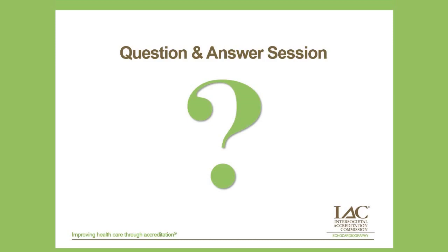So I think it's important if you do an echo when a person is in AFib going fast, to try to repeat that echo when their heart rate is controlled or they've been cardioverted, because you wouldn't want to send that patient to mitral valve surgery if it's all secondary to the atrial fibrillation. If the AFib rate is controlled, if their rate is 60 to 80 and it's relatively regular, the usual criteria for MR work pretty well.